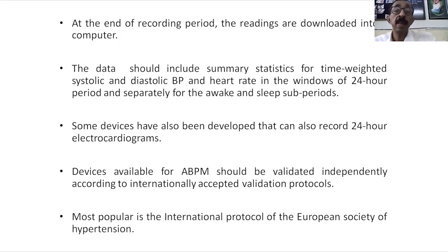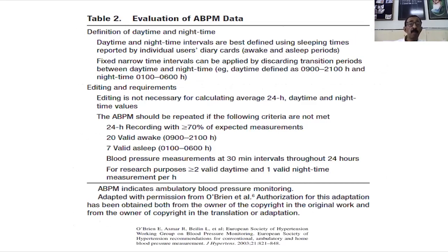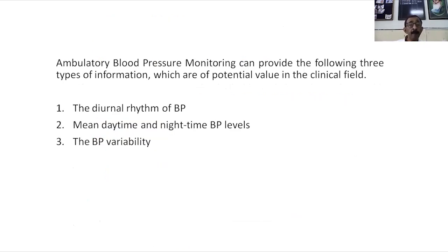This instrument has to be validated as per internationally accepted validation protocols, and the most popular one is the International Protocol of the European Society of Hypertension. This table shows the European Society of Hypertension recommendations for evaluation of the ambulatory BP monitoring data.